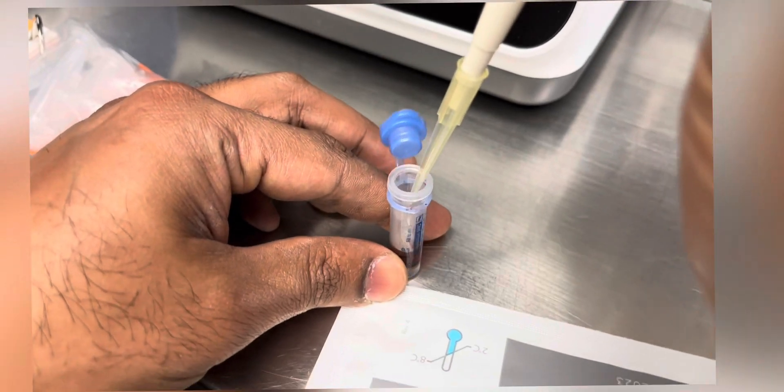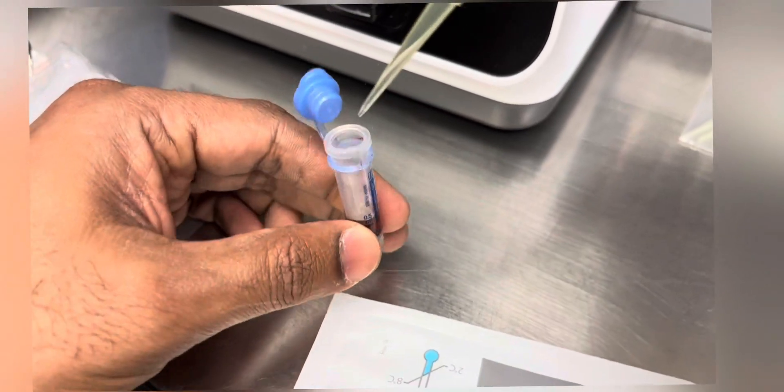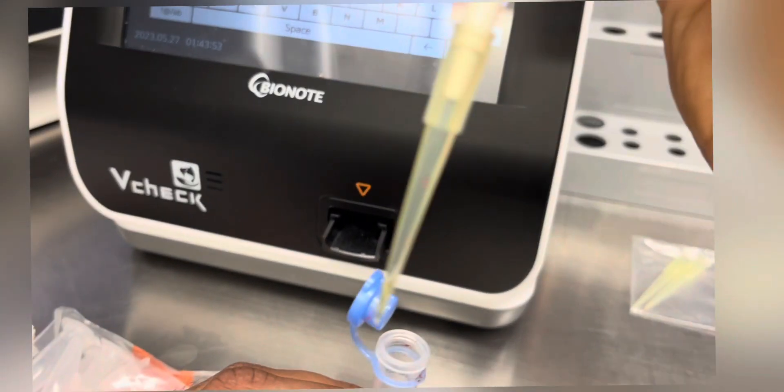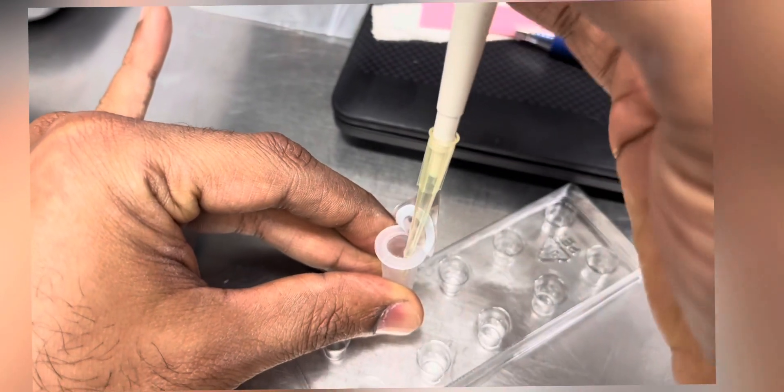We have to draw five microliters of plasma and add it to the acid diluent tube, and then using a hundred microliter pipette we should mix the sample five to six times.